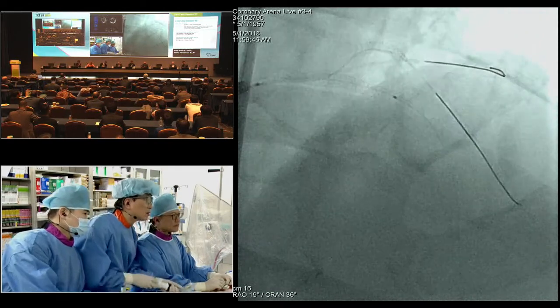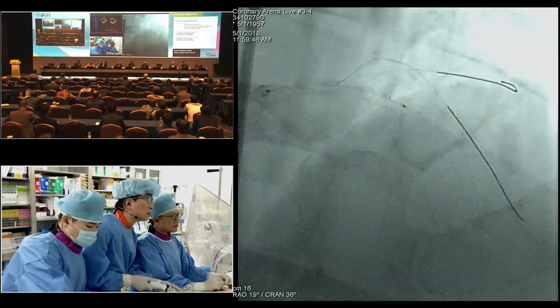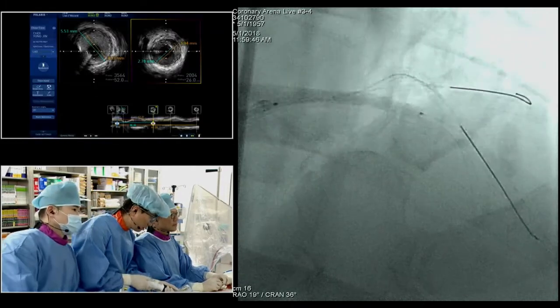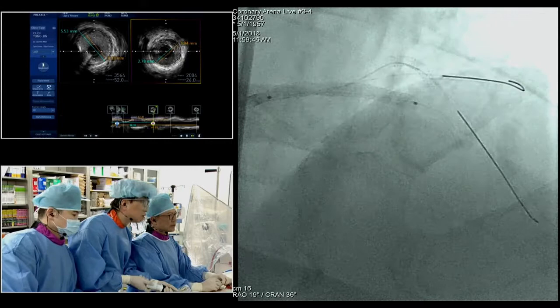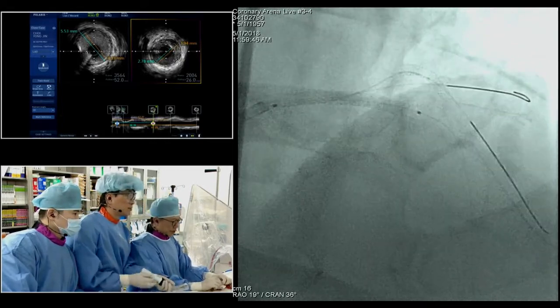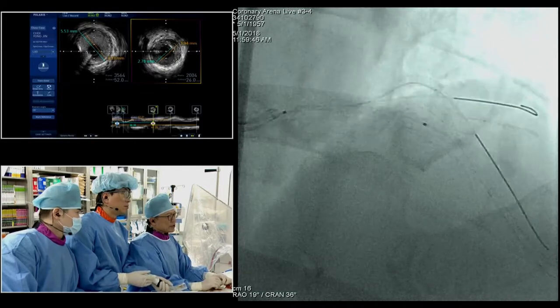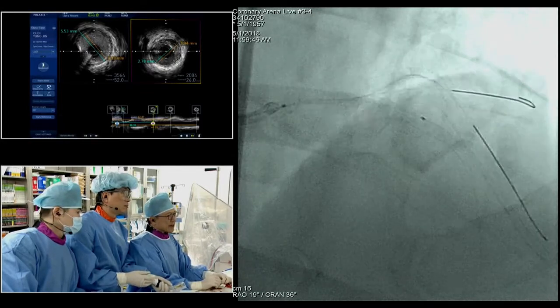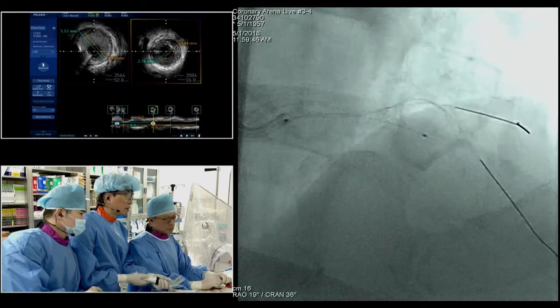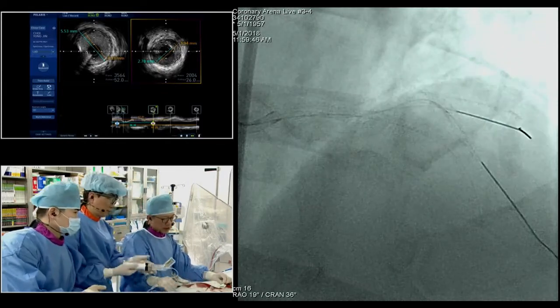Okay. A little bit. Come back a little bit. Okay. 10, 12, nominal 12, 11. Yeah, that's good. And then we can evaluate. So we're going to nominal for now because we just want to take a look at how the circ reacts. This is good, the more cautious way of doing it. Okay. Coming up.